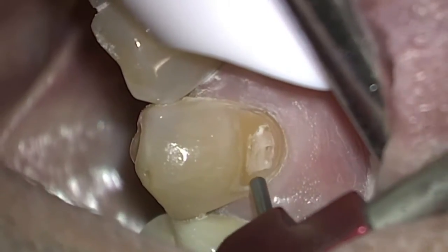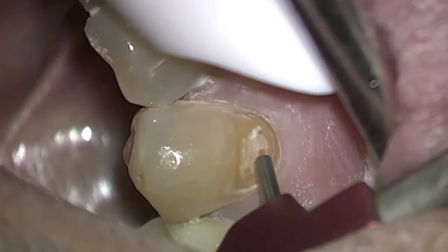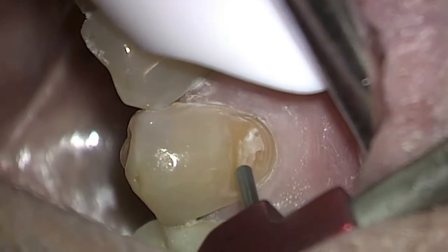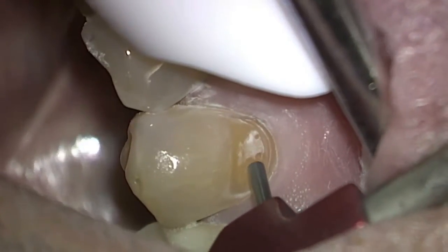When you have the power down on the micro air abrasion unit, it just polishes teeth. It just removes all the surface contaminants. As you power it up, as you can see, you can actually remove fillings.